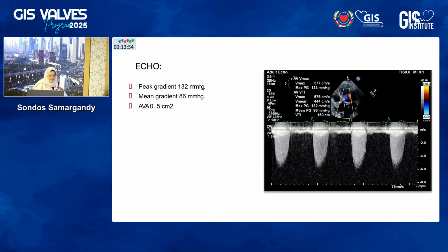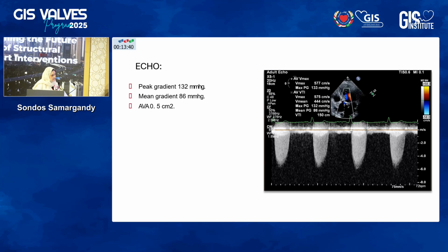Yeah, so one of the things that we often find in patients with a bicuspid aortic valve is a larger LVOT, and this results in the overestimation, or a higher calculated aortic valve area. So oftentimes you have some discordance, where you have a valve area that's 1 or above 1, when you have a Doppler mean gradient that's around 40. So I often find myself relying more on the Doppler assessment.